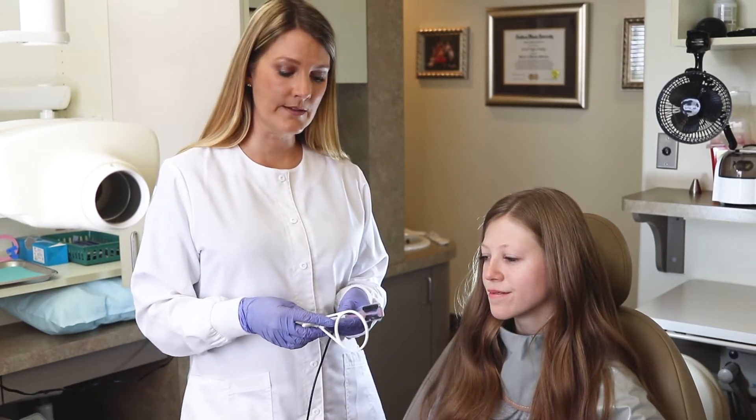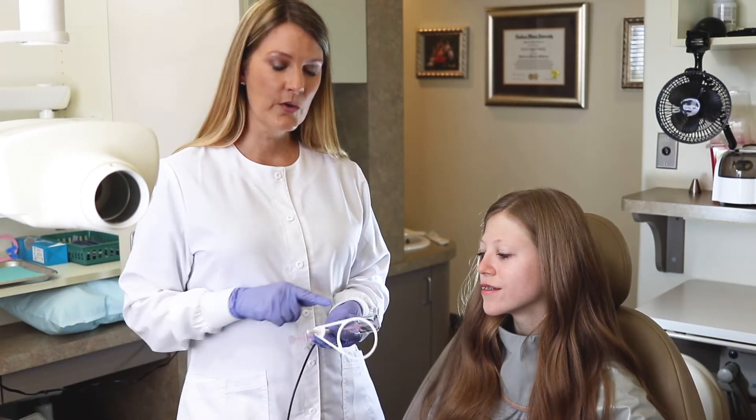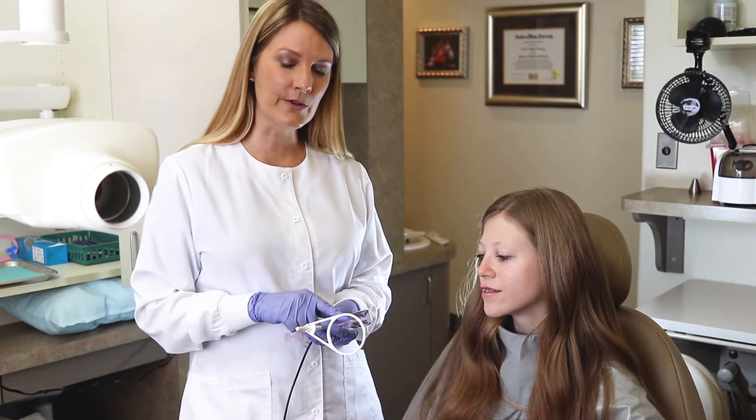Hi, my name is Susan and today we're going to show you how to do a full FMX using the ComfyRay XT Skinny all-in-one holder with your Dentimax Dream Sensor.